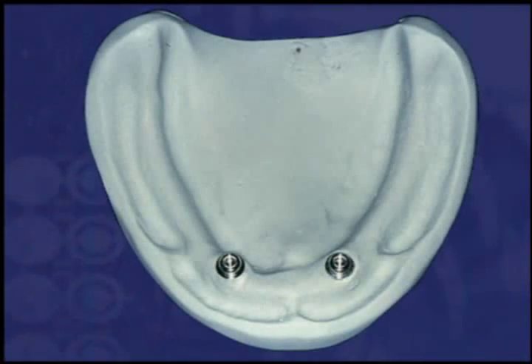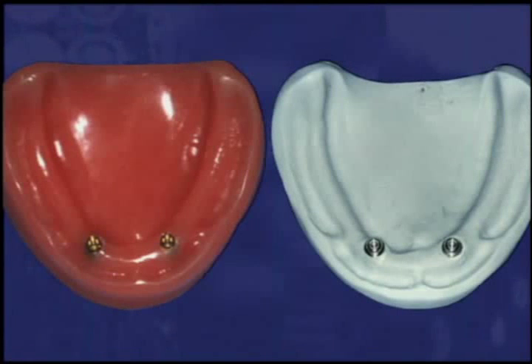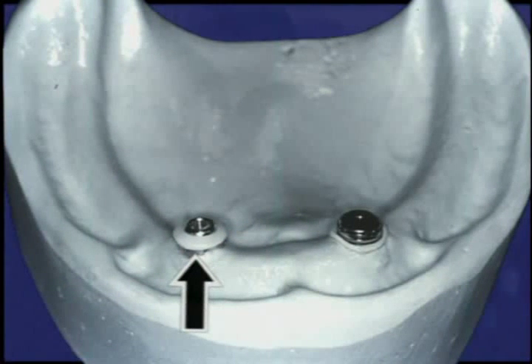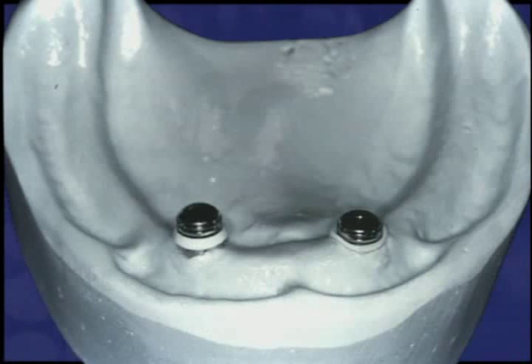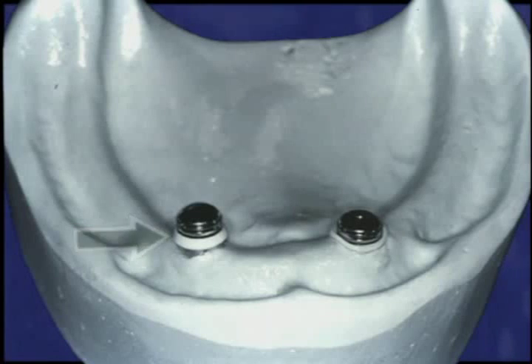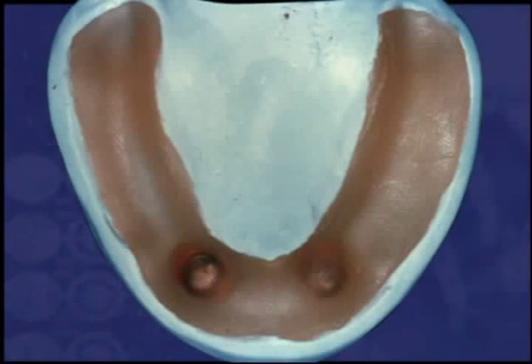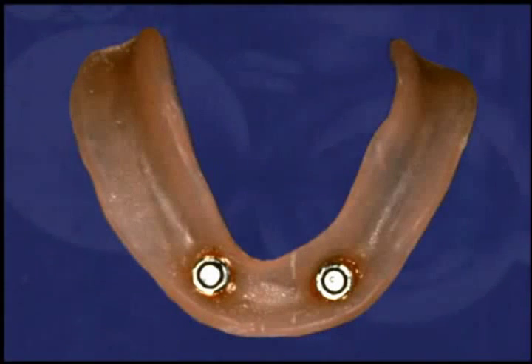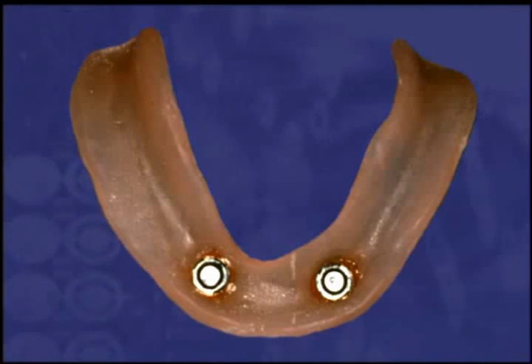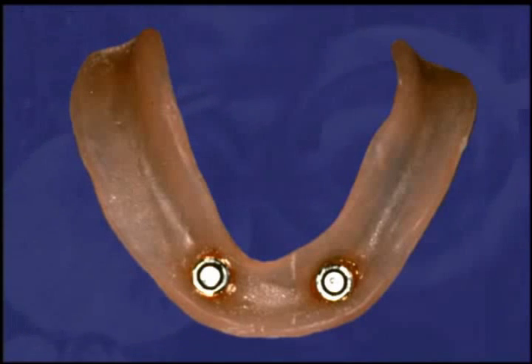The master cast is poured incorporating the locator abutment analogs, which replicate the exact position of the locator abutment in the acrylic model. Place a white block out spacer over the head of each abutment analog to block out the immediate surrounding area. Snap a locator black processing cap male onto each analog leaving the white block out spacer beneath it. Process the males into the denture base with light cured or self-curing acrylic resin. Discard the white spacers. Damage to the final male can be avoided by polishing the denture base before changing the black processing males to the final nylon retention liners.